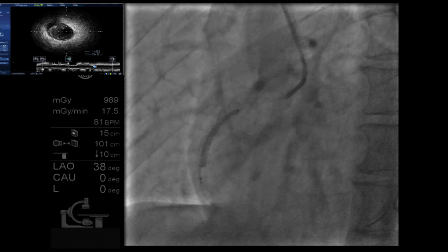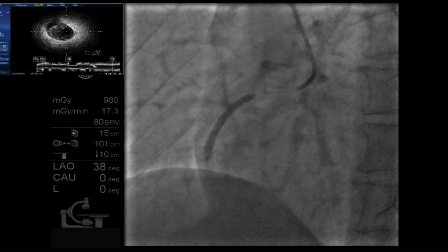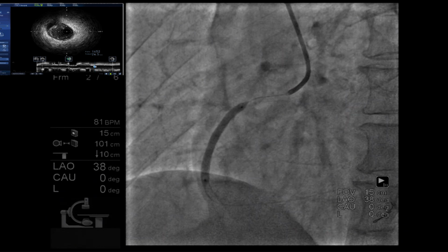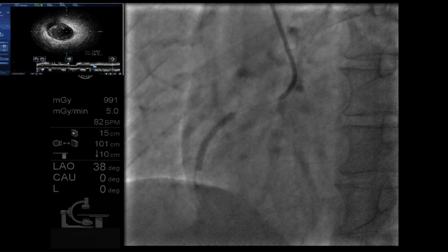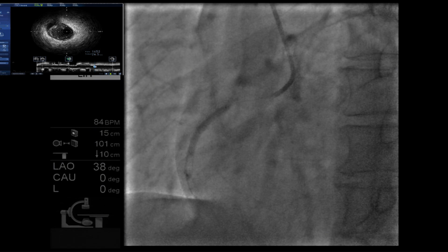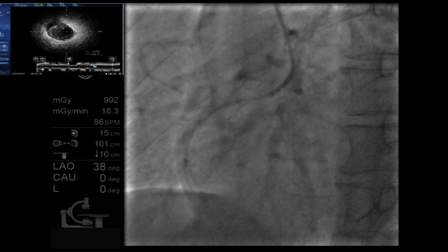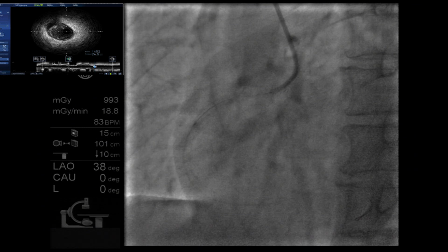This is very important to flare up that proximal edge. Otherwise, the next stent which is coming in will make it very difficult for the second stent. So we have to flare it up with a high pressure balloon. That will prepare the proximal edge of the stent to receive the next one. Take a picture here. Okay. Ready?